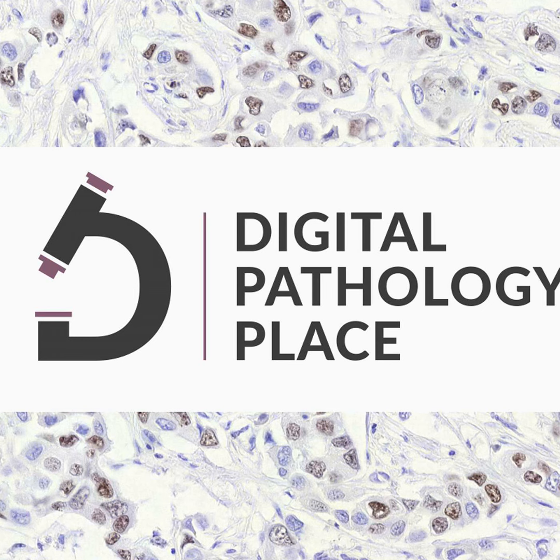The second thing, I guess, the point you mentioned, I consider DP at this time in history, DP and algorithms, as a bolt-on, right? We've got 40 years plus of using, we're getting better at it, right? Automated IHC staining. We have several predictive companion diagnostics there where pathologists read the slides and a treatment decision's made. We've got hundreds and hundreds of so-called class 1 stains in the United States that are used as a basis of diagnosis and prognosis. And everything happens with that being read on a microscope, just fine in the lab now.